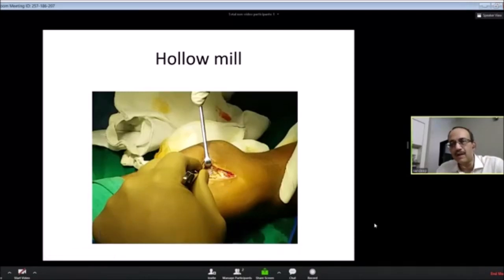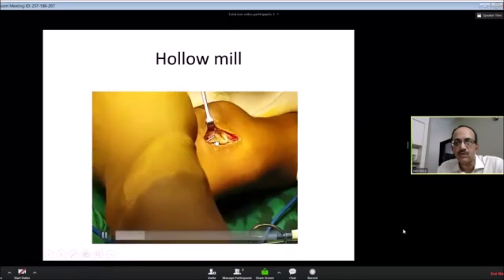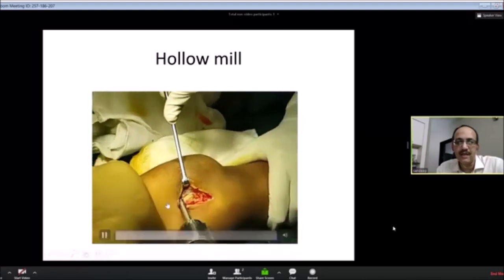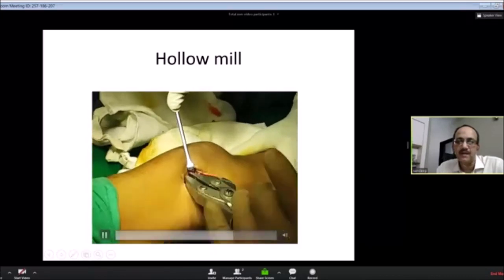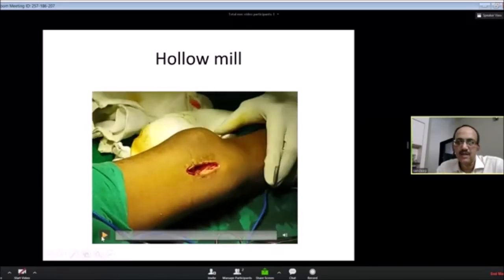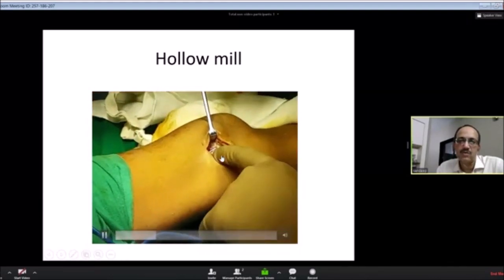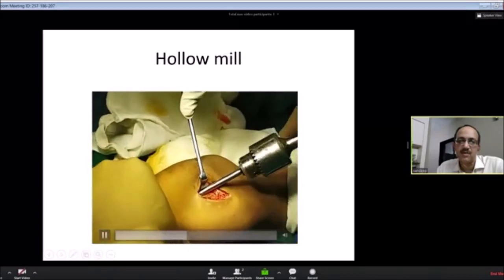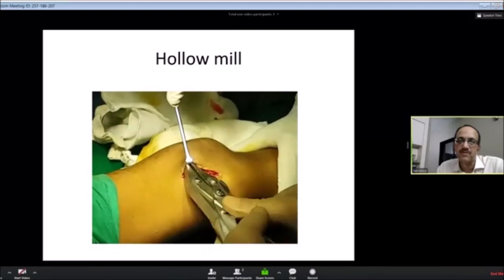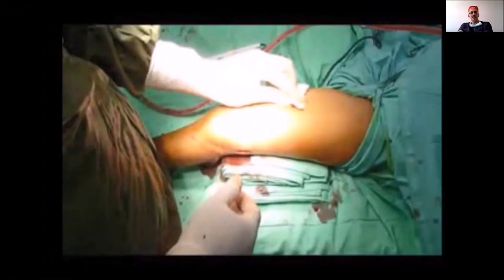I'll show you a small video of what I do with the hollow mill. You can see the nail tip here — this is a femur nail I am removing, the tip flush with the cortex. Insert a hollow mill around the nail tip, then bend the nail 90 degrees. Once bent, your plier can grip it very well, and you can back-hammer it out. It is a small area and very difficult to hold a straight nail tip — bending it makes it so easy. One centimeter left outside flush with the cortex; pass the hollow mill, turn at 90 degrees, grip with plier, and back-hammer it out.